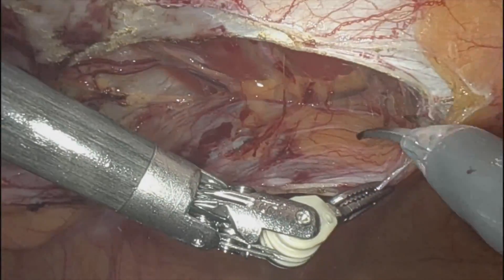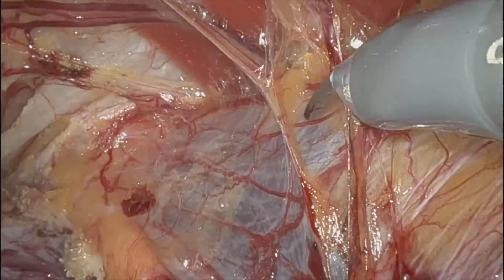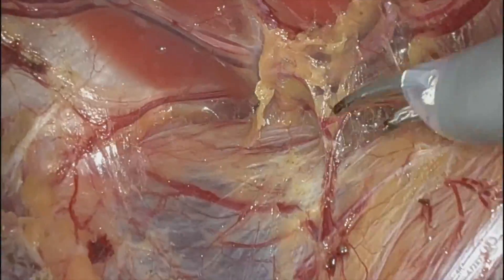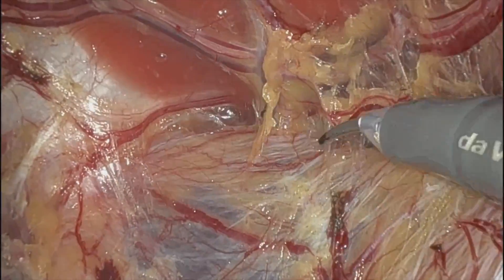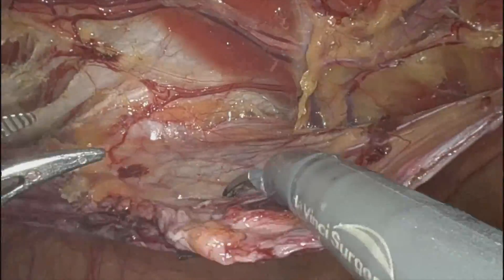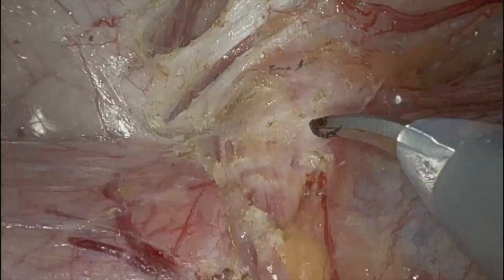Not entering into the oblique fascia. Just creating my pocket now, electively. Trying to go all the way down as low as I can. I'm coming on top of the hernia defect now.